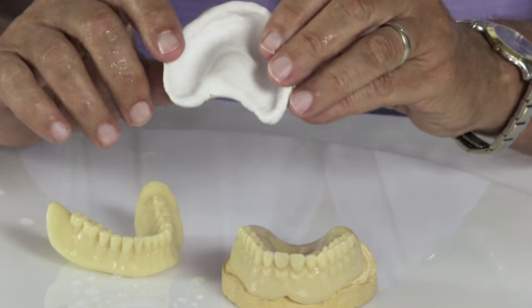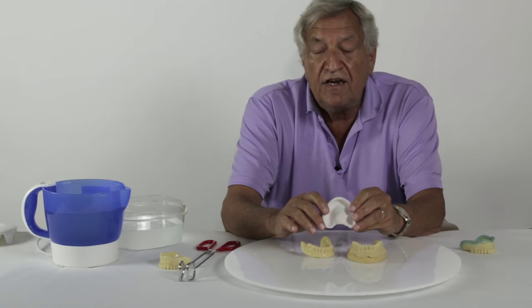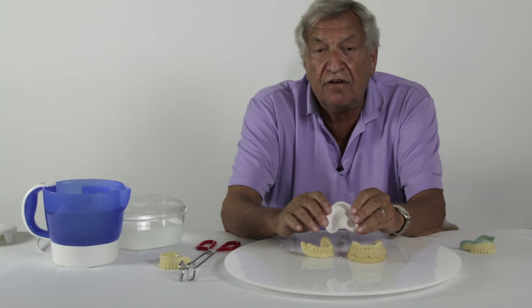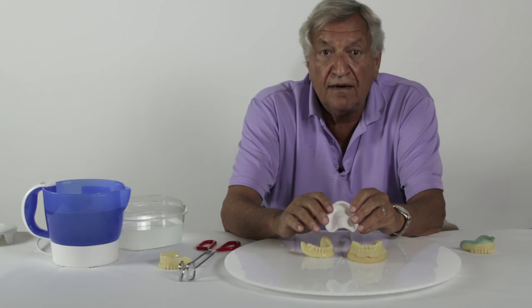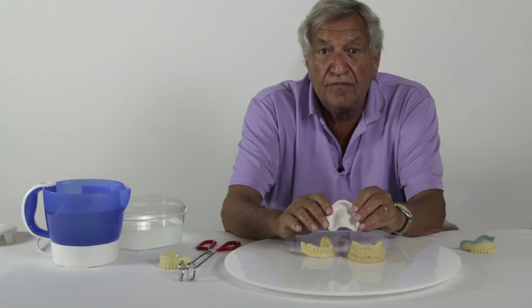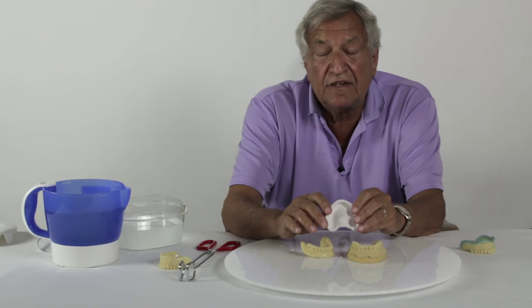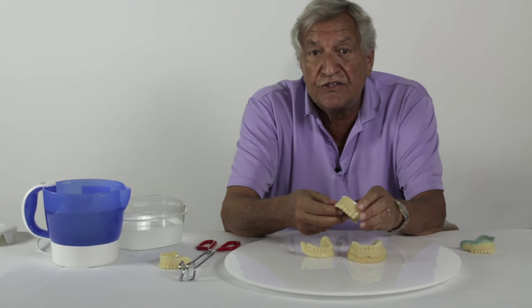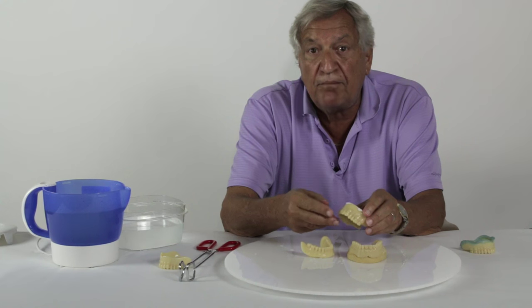Once the final impressions have been made, the normal technique would be to send the impressions to the laboratory to have them fabricate wax rims and bite blocks. These are gone forever with the GoodFit system, because rather than send these to the laboratory, the dentist goes right back to the mouth and uses them in place of wax rims and bite blocks.